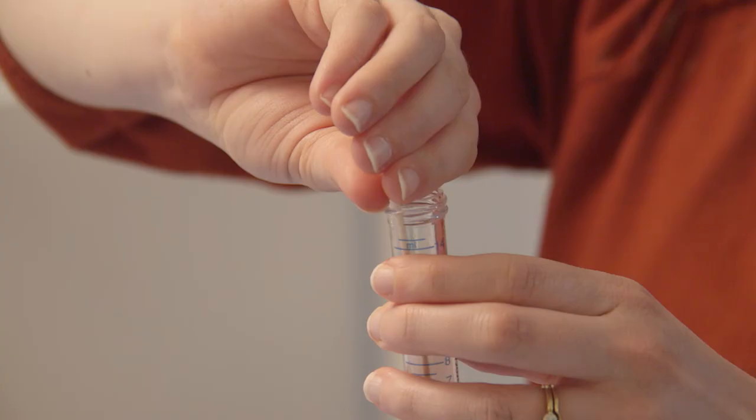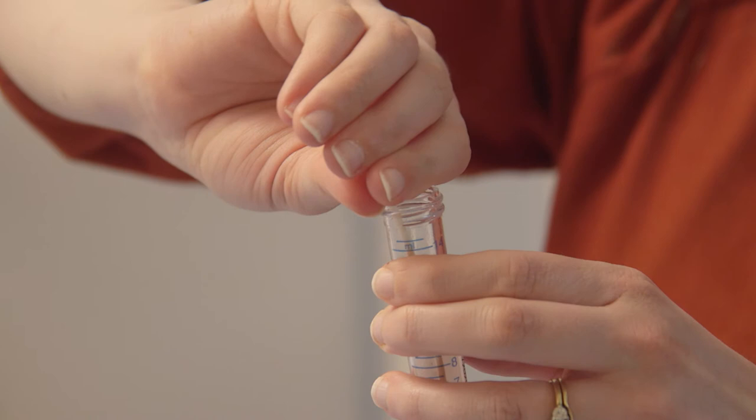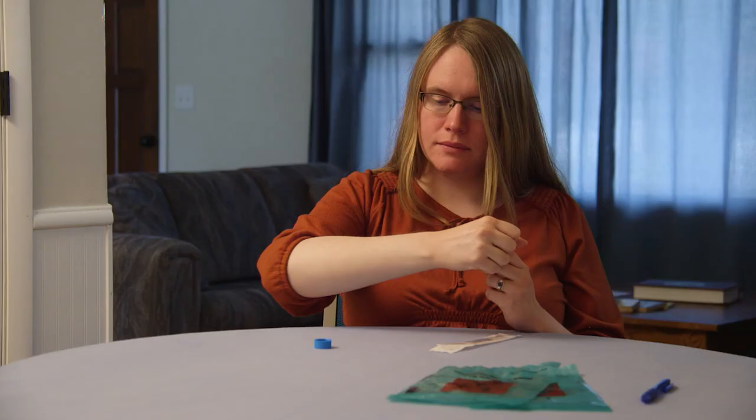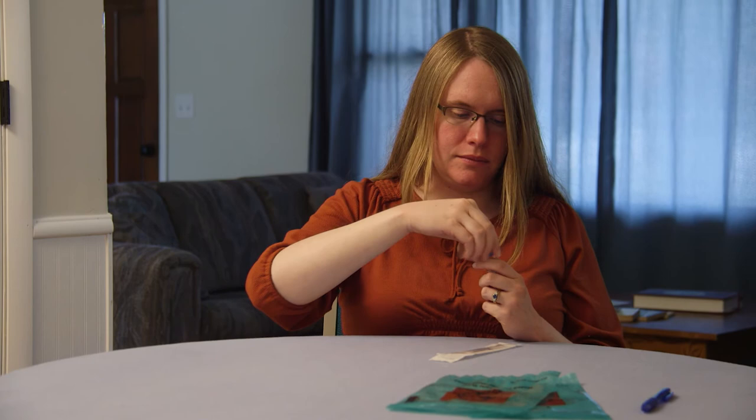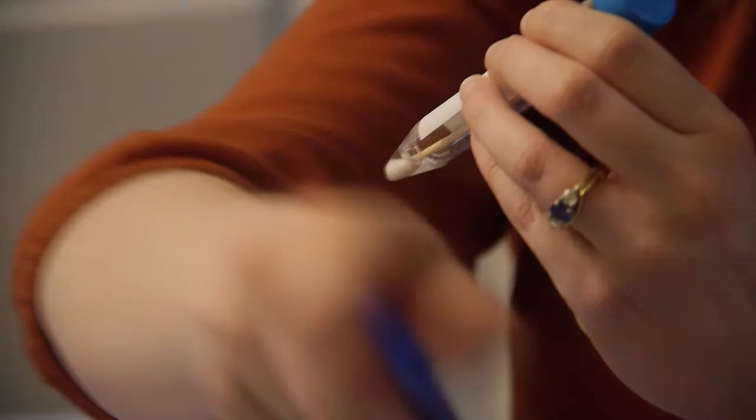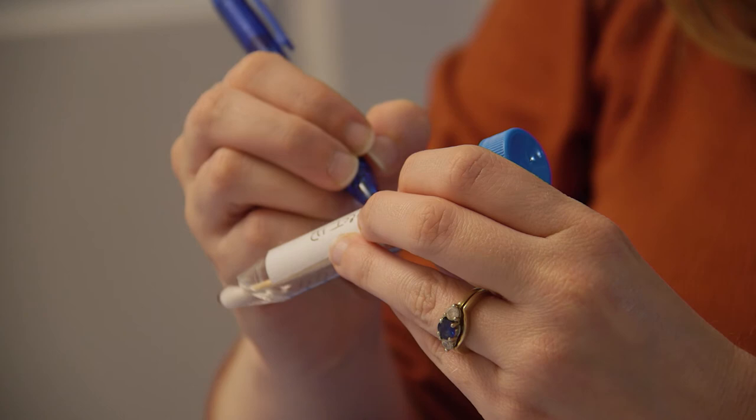When you are finished, insert the swab into the tube. Break off the end of the stick so that it fits inside the tube. Screw the cap on securely. On the tube label, write the date and time the sample was taken.